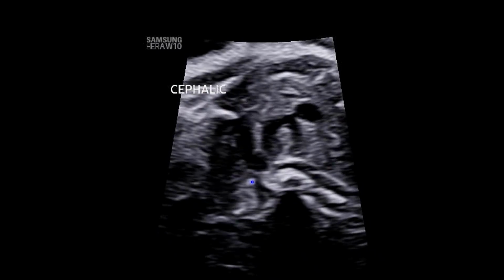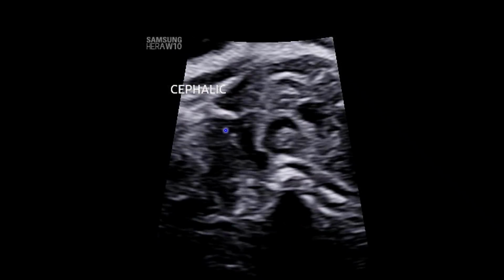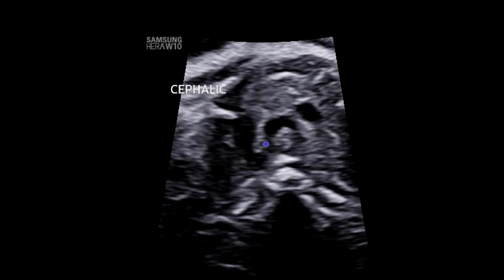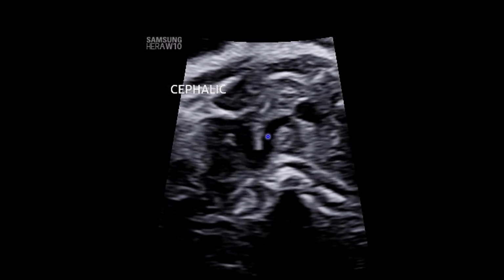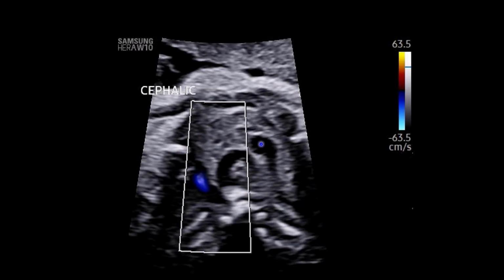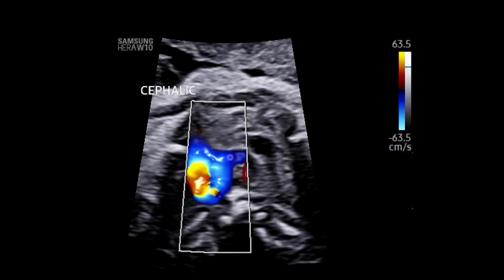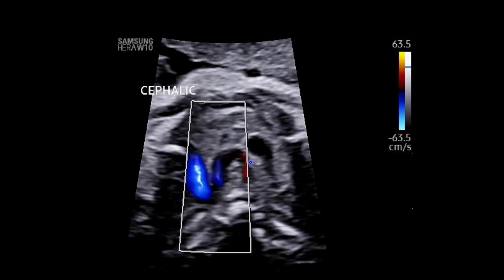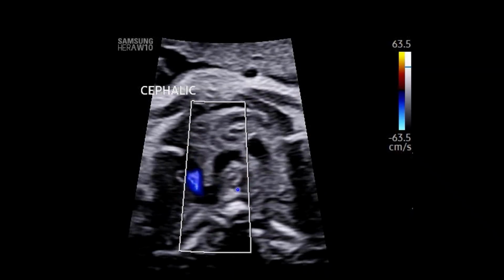Now this is also a double aortic arch, but at the end of this sweep you see a cephalic presenting fetus, and we're seeing levocardia, so this is left and that's right, but you see this V form, and this is a typical appearing three-vessel tracheal view at the end of the sweep with a V. But when you turn your attention to what's on the other side of the trachea, this is a systolic flow signal, and you're seeing the dominant looking larger left-sided aortic arch and a smaller right-sided aortic arch, which is very atypical. We don't typically see this configuration.